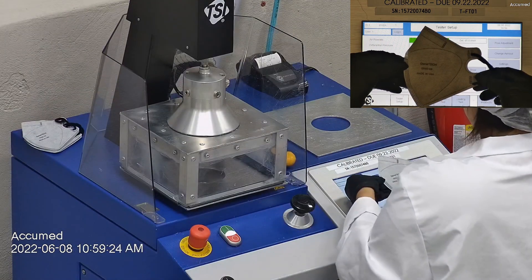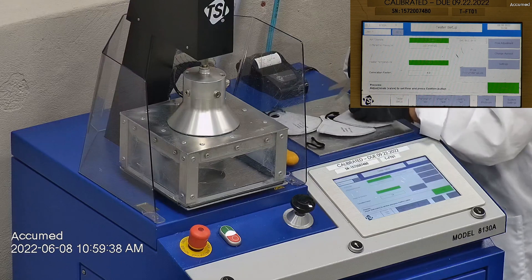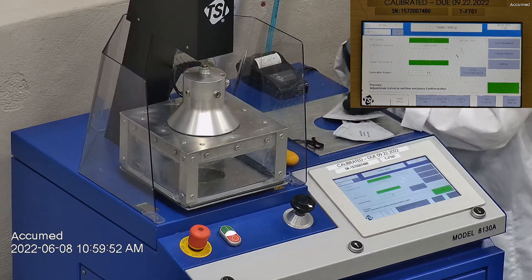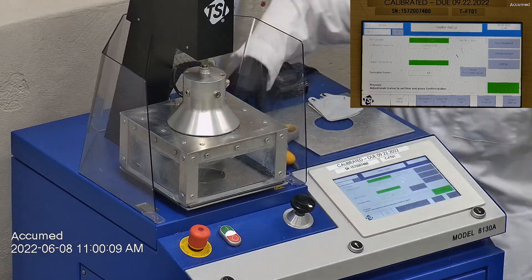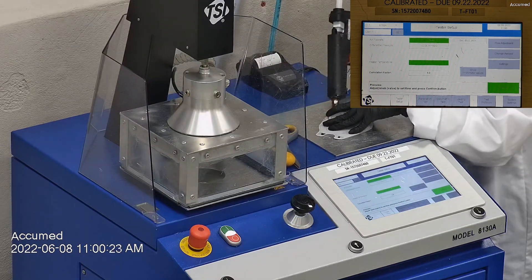We're going to be testing both the filtration efficiency and the pressure drop. This is our TSI machine model 8130A, which is also the same filtration testing machine that NIOSH uses to approve N95 respirators. Our procedure is inspired by NIOSH. We first run a tester setup and start removing the ear loop bands from the mask before placing it onto a testing plate to ensure a proper seal.